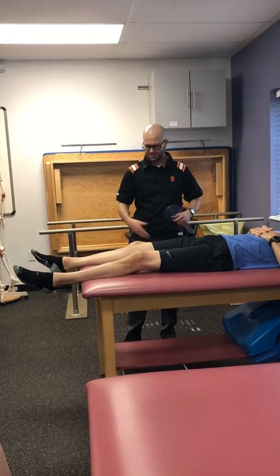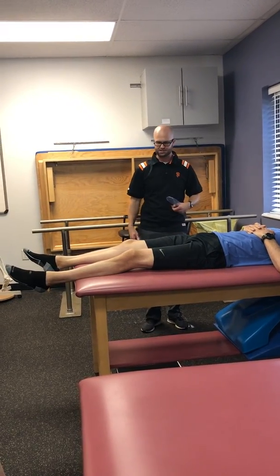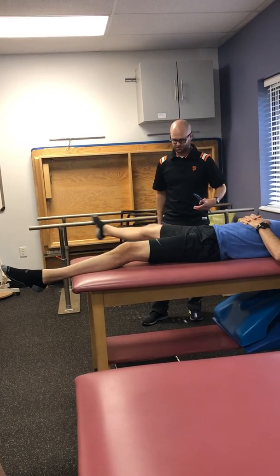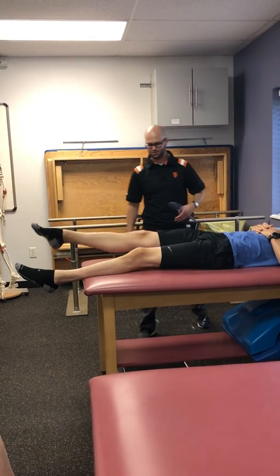So if that's his passive, now I can say, hey, I want you to actively kick your leg out, just like I passively took it through. Again, try and keep those toes up. There we go, just like that. There, that was better. Okay?